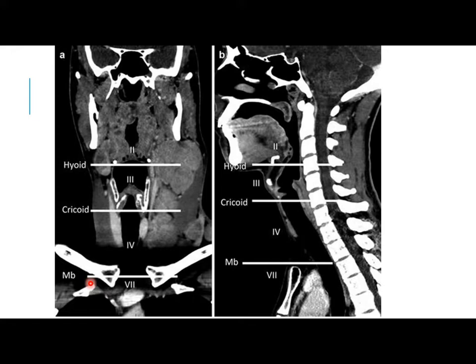In these cases, it may be difficult to differentiate malignant causes from inflammatory causes. Sometimes even in malignant lymphadenopathy, the capsule will rupture and there will be stranding, and we cannot differentiate. So this may occur also in malignancy. In these conditions, only the biopsy will guide us to the final diagnosis.